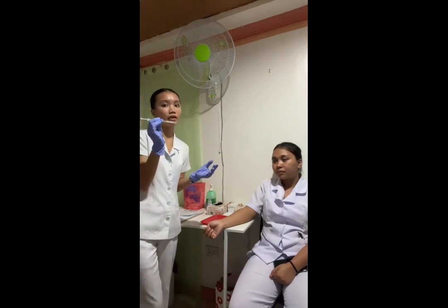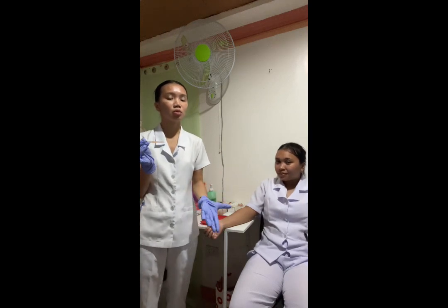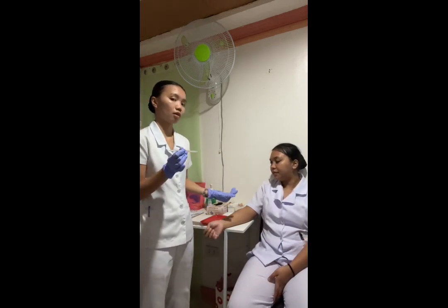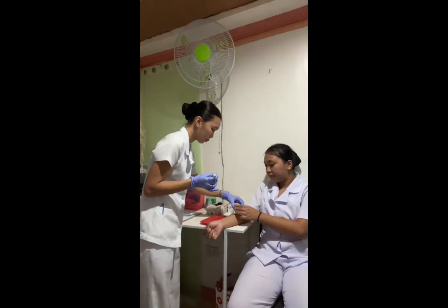Hold the needle almost parallel to the skin surface, with the bevel of the needle up, because the possibility of the medication entering the subcutaneous tissue increases when using an angle greater than 15 degrees. So it should be at least 5 to 15 degrees. And then after that, we are going to inject the fluid. So can we hold this one?